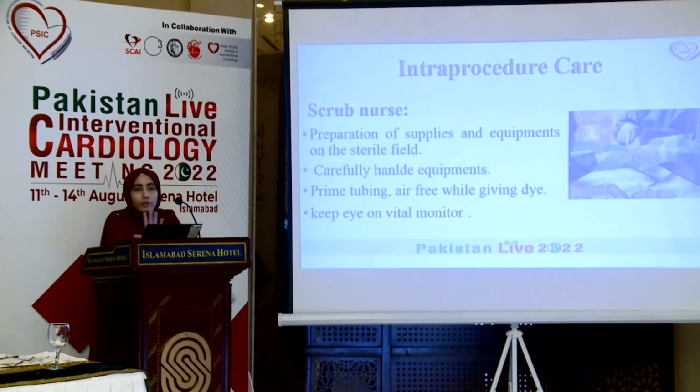Okay, no problem. Intra-procedure care is the care we give to the patient during the procedure. Overall, during the procedure, all the health professional teams must be active. The scrub nurse prepares supplies and equipment on the sterile field, carefully handles equipment, primes tubing air-free while giving dye, and keeps an eye on vital monitoring.